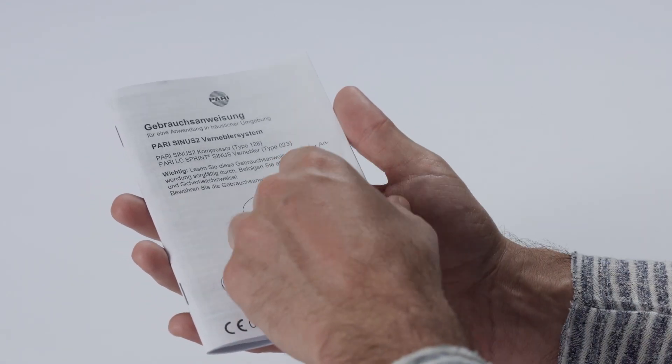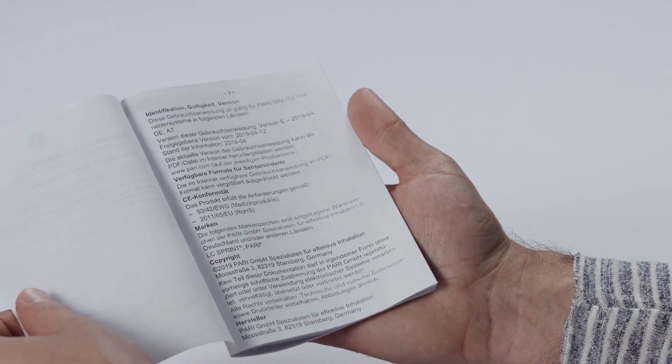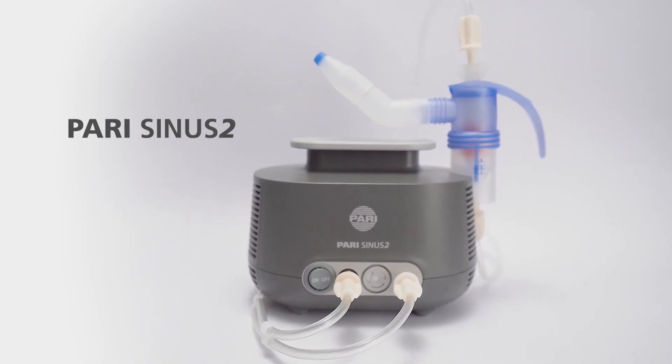Always refer to the instructions for use for details on how to use and clean your PARI Sinus 2.